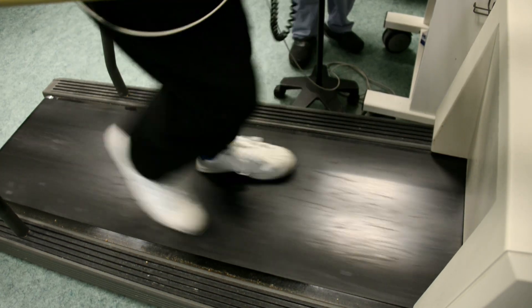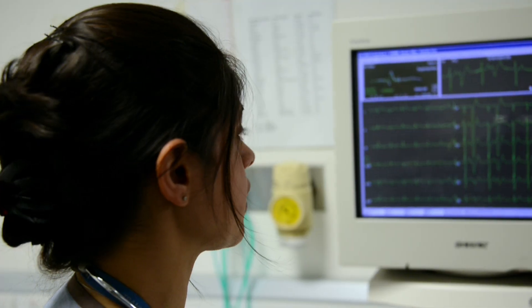This film will show you what to expect if you are having an exercise ECG, often called a stress or exercise test.